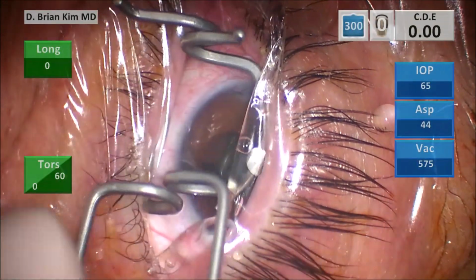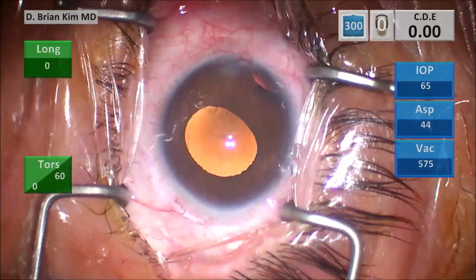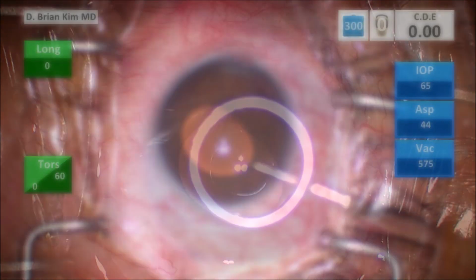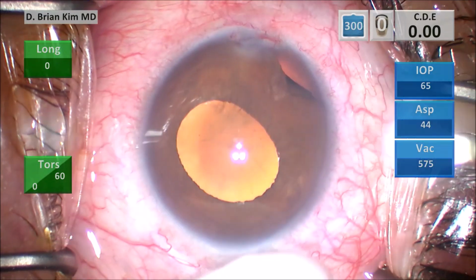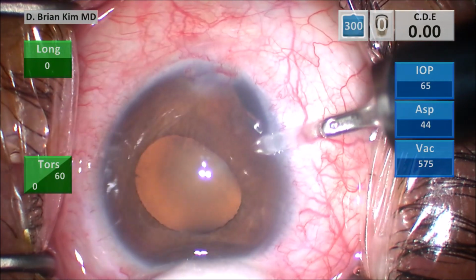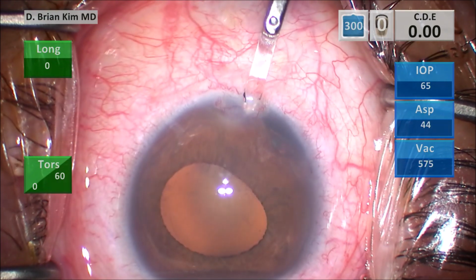That narrow wire speculum provides better exposure of the sclera, which is important in this situation because I'm going to be repairing that iridodialysis, which requires a peritomy and a scleral incision. I use a corneal mark, which will help me to center my rhexis, and then these are my incisions for the surgery, as well as incisions to place my iris hooks in order to retract that pupil.